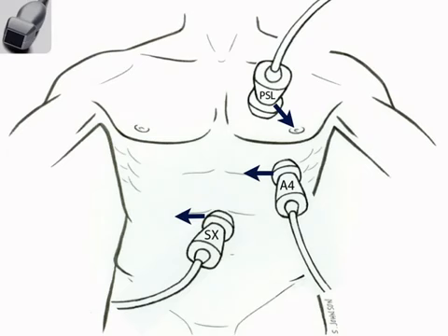So recall that last year when I came to you, we talked about the different locations to point the probe. And the one way is here against the parasternal long axis. This is where, as its name suggests, parasternal, para means next to, sternum. You place it right along the edge of the sternum and you aim the indicator down towards the patient's left, somewhere between, if their arm was at their side, their left elbow or their left hip, in this kind of direction this way.